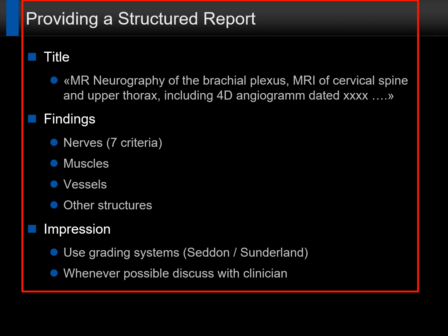I always recommend, not only in MR neurography exams but in all my reports, that you use a structured report. So give your report some kind of structure, keep it simple, and always keep the same structure, so you don't miss anything. You will train your referring physicians to read it, to understand it, and to get a feeling for what you mean. That's very important.